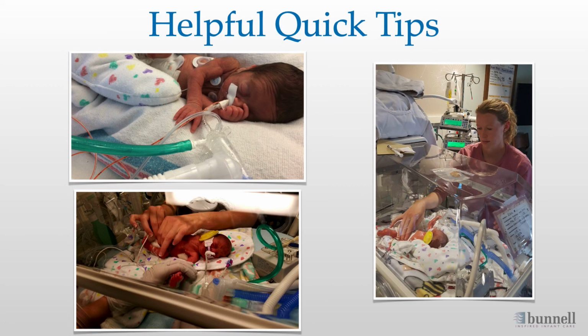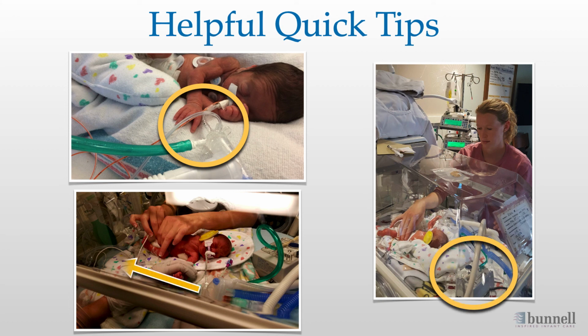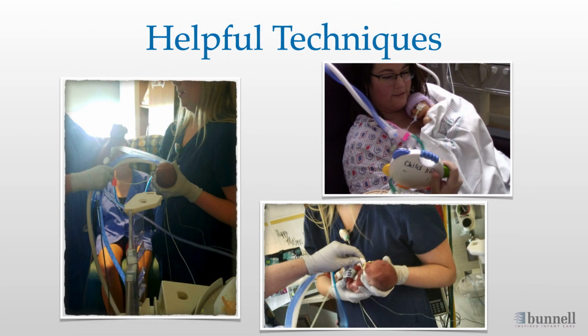The pressure monitoring line facing upward helps prevent moisture from blocking the line, interfering with the displayed monitored airway pressures and causing nuisance alarms. The patient box can be placed on a blanket, a gel pad, or a towel. Make a pillow or a nest to help reduce noise and vibrations. Avoid placing it against the plexiglass wall or the metal ridge of the bed scale. It may be placed in any area of the bed. Unused corners work well. A helpful hint, scoot the baby down in the bed to give yourself some extra room.